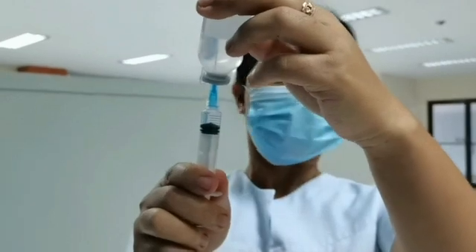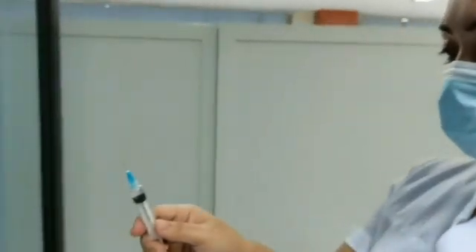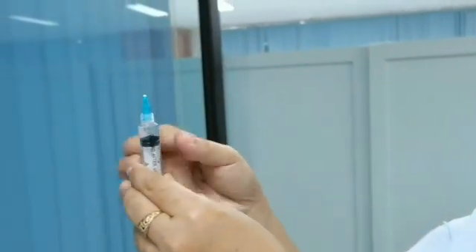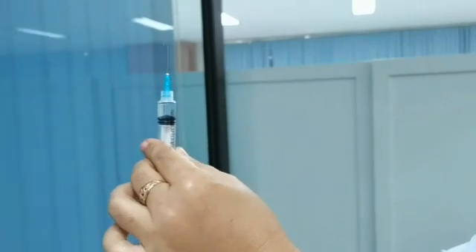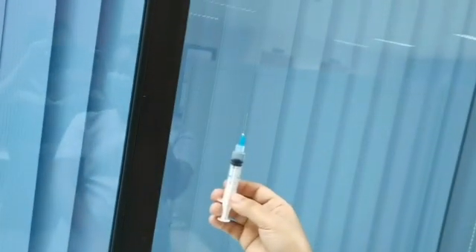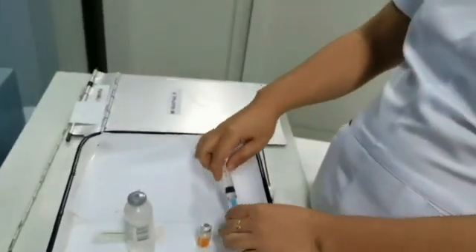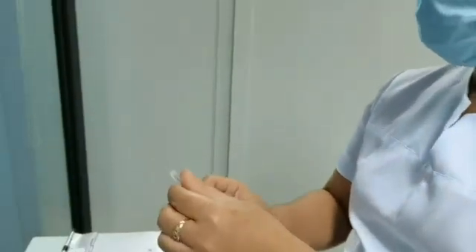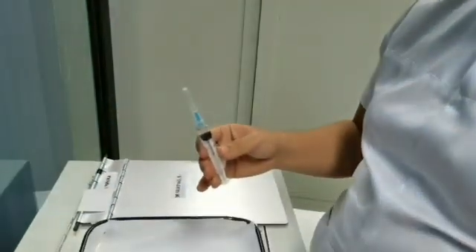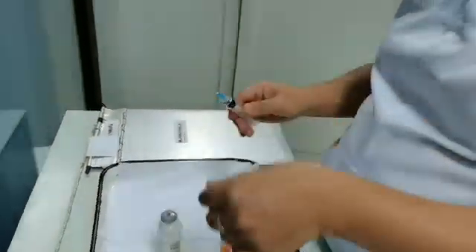If air bubbles enter the syringe, gently flick syringe barrel with fingers of dominant hand. Keep a finger on end of plunger and continue holding vial with non-dominant hand. And push plunger in until air is out of syringe. Withdraw additional solution if needed. Pull needle out of bottle while keeping your finger on end of plunger. Apply needle to syringe if IM or sub-Q or intradermal injections will be given.